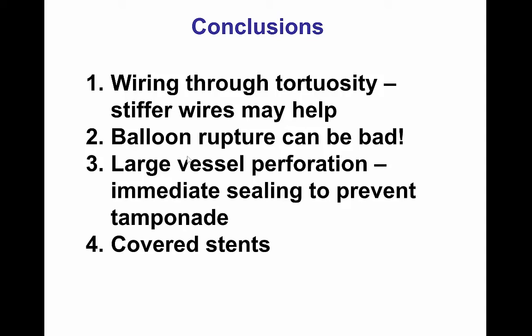Lastly, when a perforation like this occurs, covered stents can be literally life-saving. In this case, although we appeared to achieve hemostasis with prolonged balloon inflation, everyone felt much greater peace of mind by deploying a covered stent at the perforation site to ensure there would be no reopening. Thank you very much.